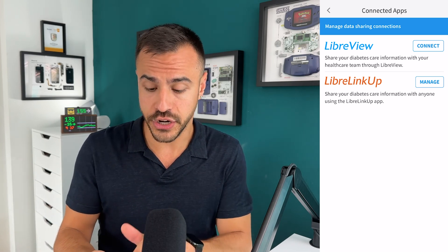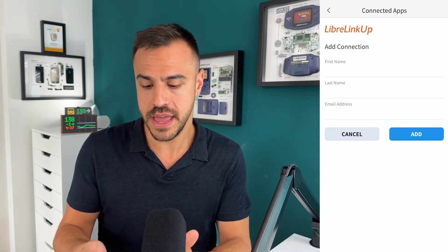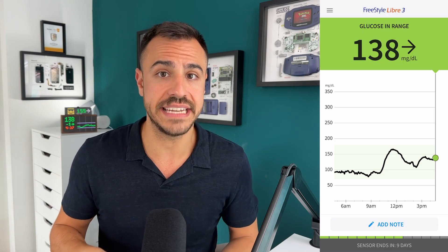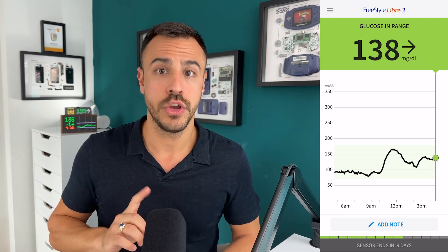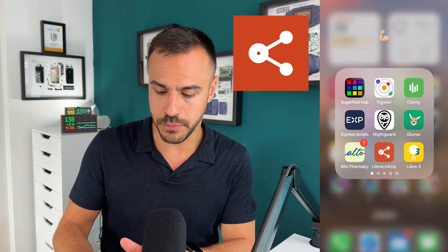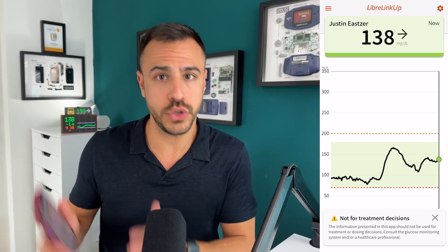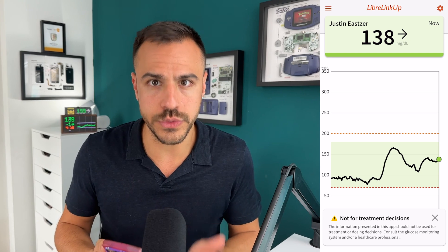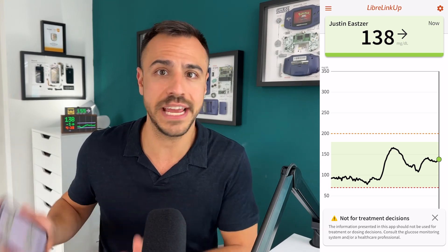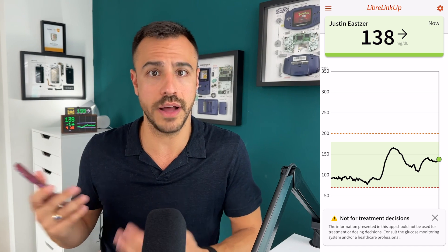That's going to come in key. So you're going to go here, go to Manage, and then you would add a connection, adding a name as well as an email. That is going to send an email to the person you're sharing with — in this case, probably you. So you're going to receive that email and sign up using that app. It's the Libre LinkUp app. You'll create a username and password for the LinkUp app, then use that email that was sent to you to sync that data to your account. You can follow up to 20 users on this app, but we're just going to use one person's data to connect it to the Apple Watch and other devices.